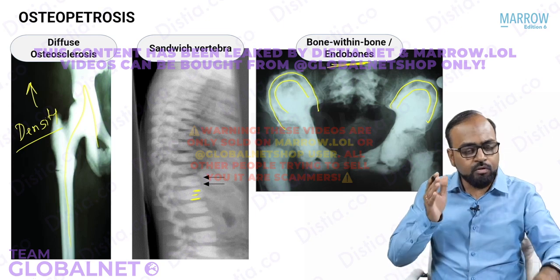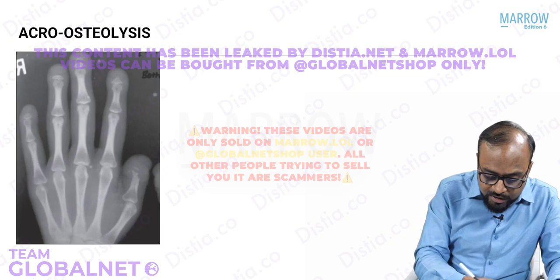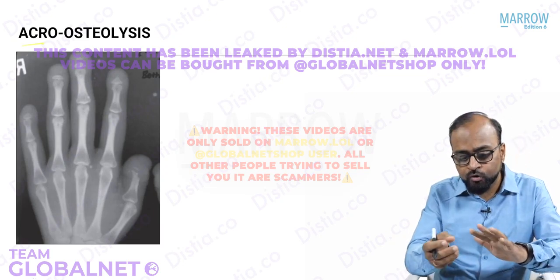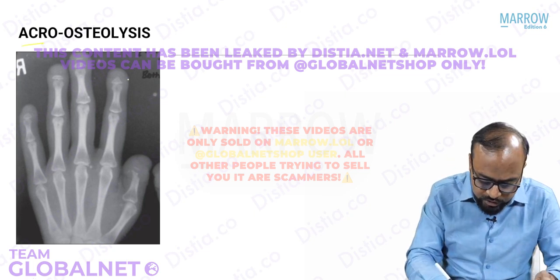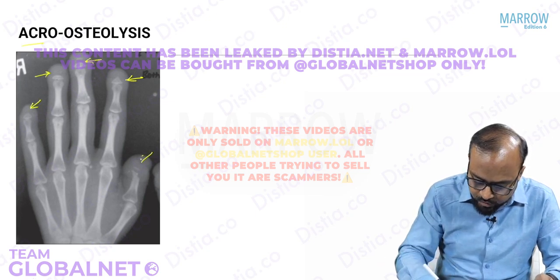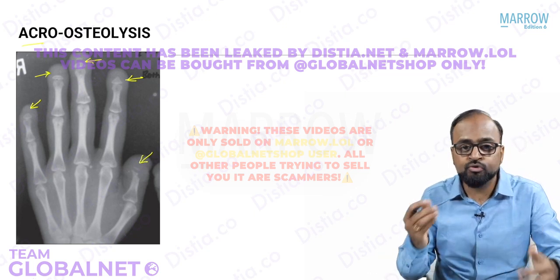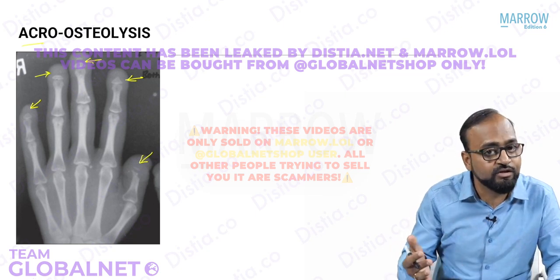Now, another typical finding which is seen skeletally, which is very prominent, is called acroosteolysis. Acro means extremity. Osteolysis means destruction of bone. So see here, if you see the distal phalanx, can you see how classically the distal phalanx is actually destroyed? Almost all the digits. Acro means periphery, bone is destroyed, osteolysis. So this is called acroosteolysis, resorption of the distal phalanx of hands.